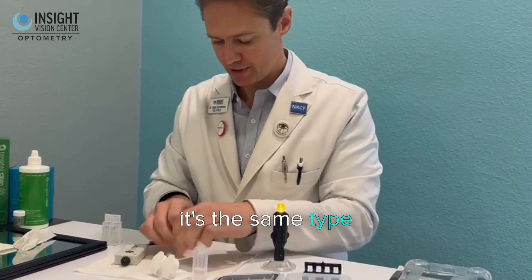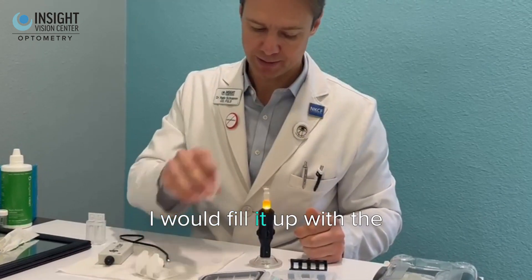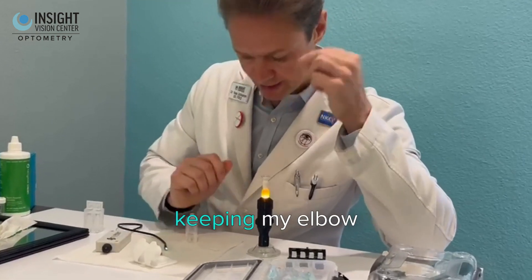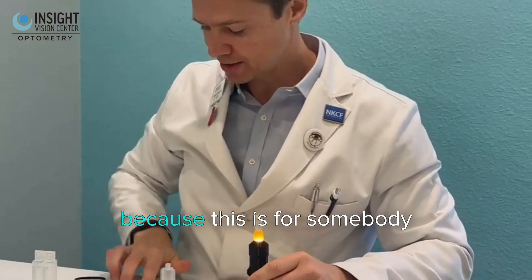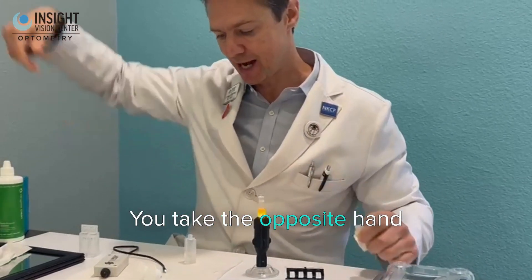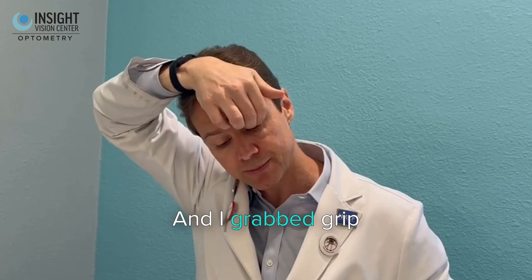It's the same type of DMV plunger — you put it on top, fill it up with saline, then aim it keeping your elbow on the counter. The better way to do this, especially for somebody who's struggling with keeping their eye open, is to take the opposite hand — so my right hand to my left eye.